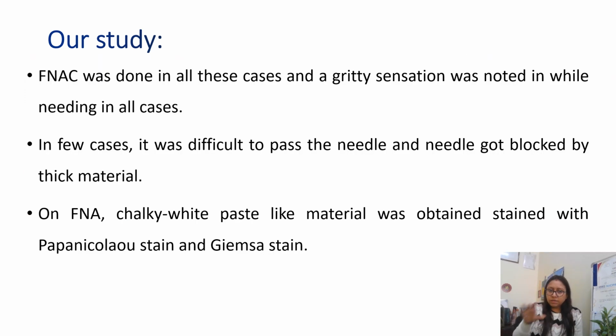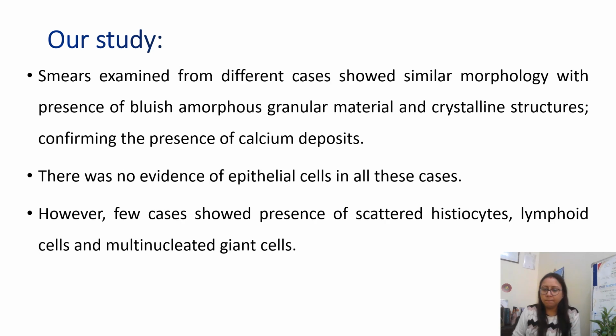So we did FNAC in all these 12 cases. When we put the needle in, there is a gritty sensation in all these cases. It is very difficult to pass the needle through, and it can get blocked with the thick material if we aspirate it. So FNA will yield chalky white paste-like, cheesy material. With that material we make a smear, and then we stain it with Pap stain and Giemsa stain, and we review it under the microscope.